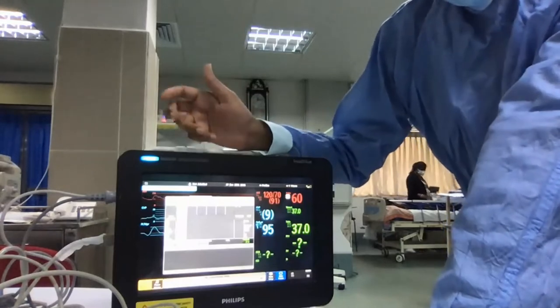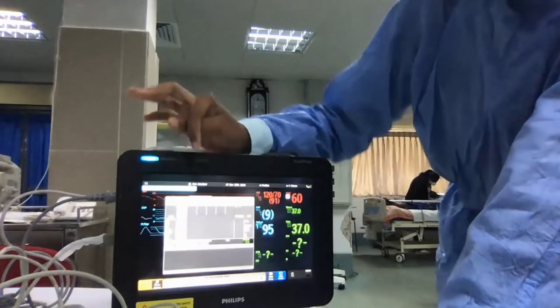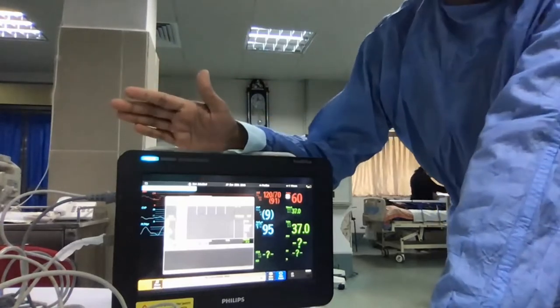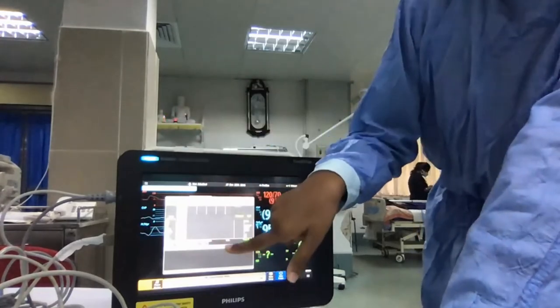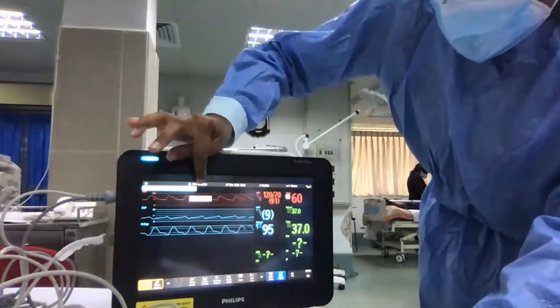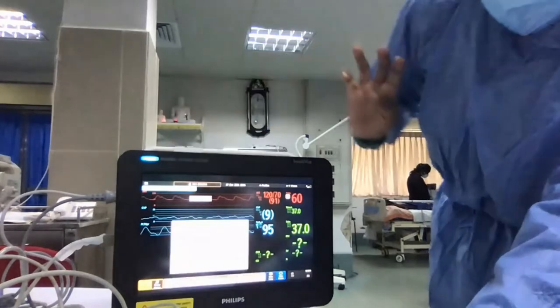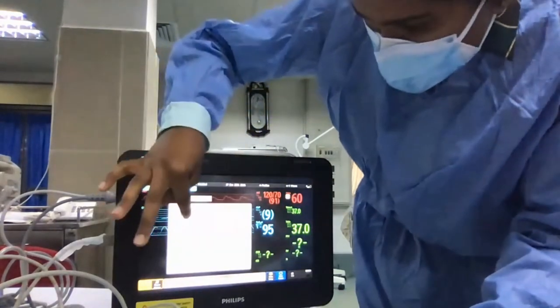I think you are anyway doing that in the ICU. If not, first of all, please enter all the patient details, especially height and weight of the patient, because only then will the monitor be calculating the BSA. So you have to enter that. How to enter it: this is the patient demographics bar. Click on it. For the moment, I will enter something.